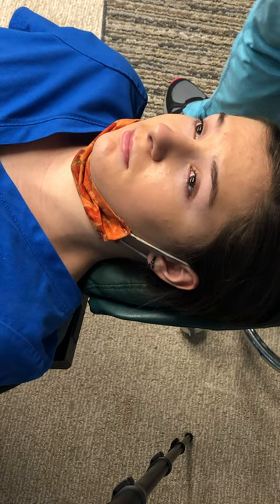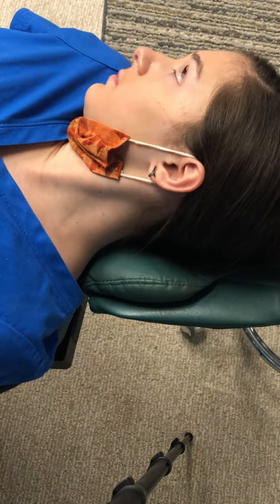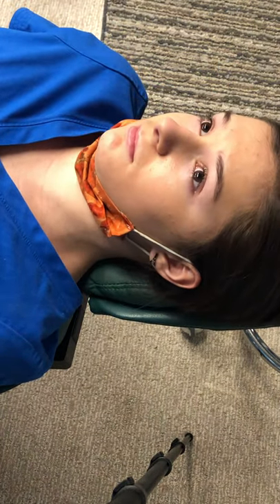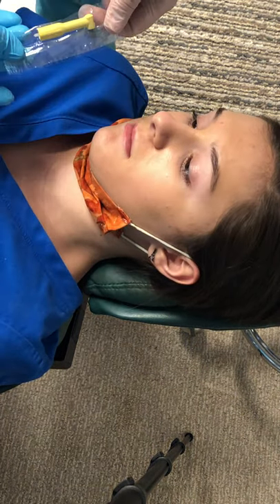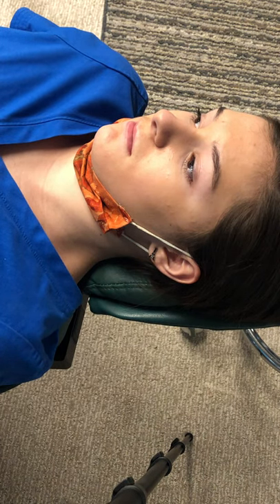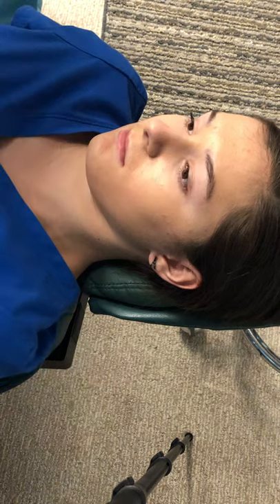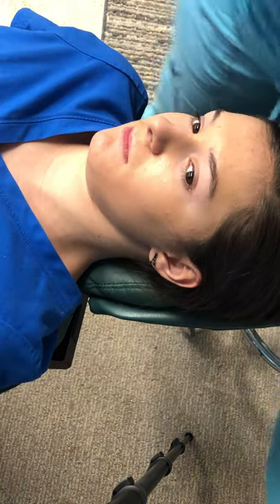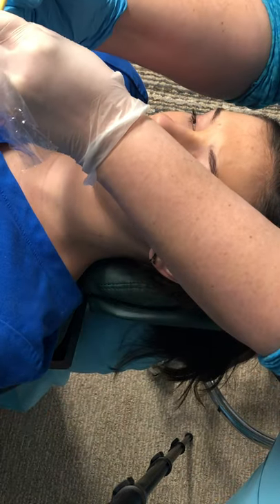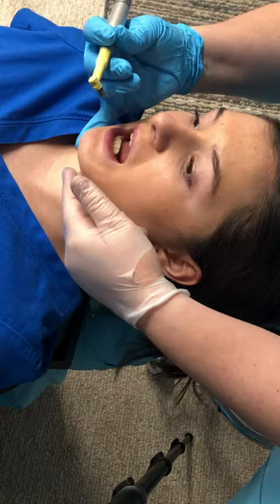The first thing we're going to do with our patient is clean her teeth before putting braces on. I have her prophy angle that I'm going to open in front of her so she knows it's clean and has not been used on anyone. I'm going to place it here and put the prophy paste on the prophy angle, then tip the chin up a little bit.